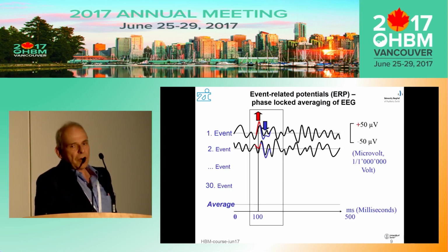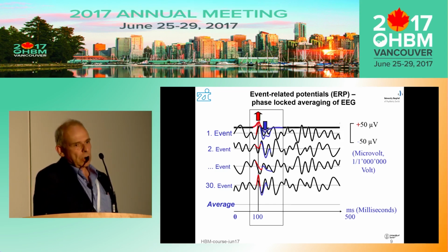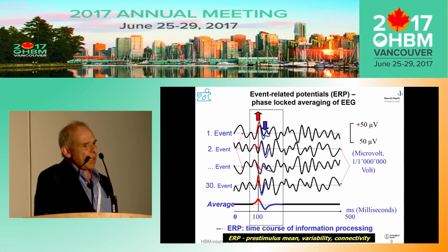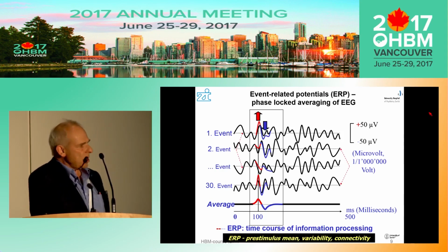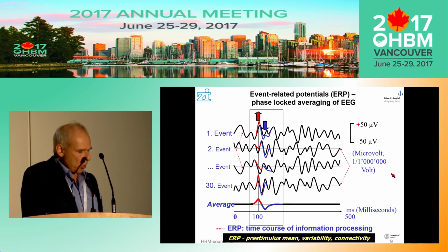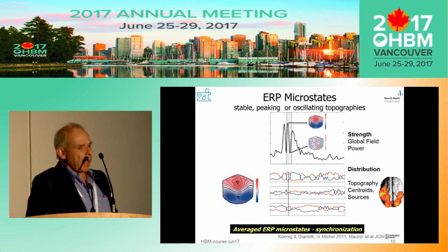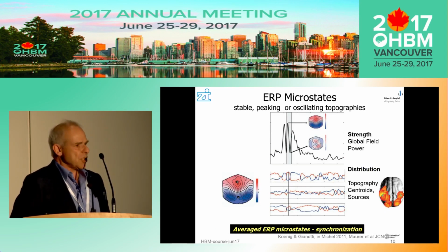If we look at just one aspect of event-related activity, the classical average evoked or event-related potentials, where we ignore the changes in synchronization, the changes in phase reorientation, and just look at what is phase locked to the stimulus, then what we find is typically an average evoked potential response, which tells us something about the course of information processing, and which typically shows up, if we analyze it with a topographic and then with source models, in stable source configurations with synchronously activated or oscillating or activating and changing generator patterns.